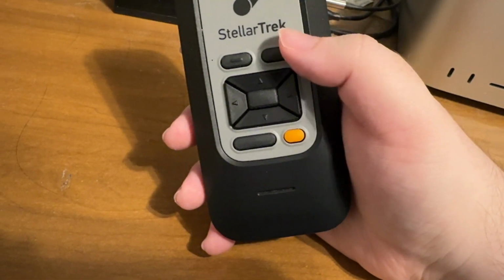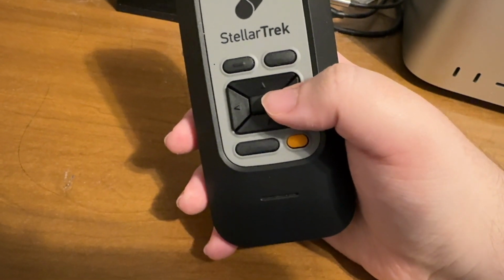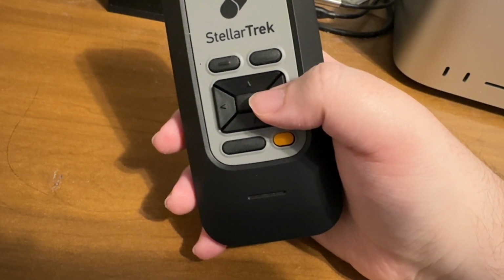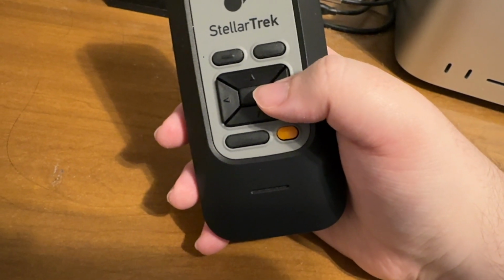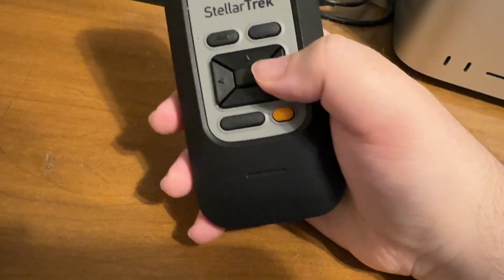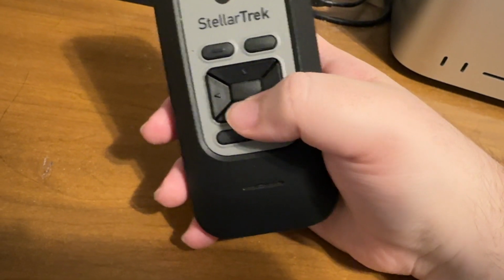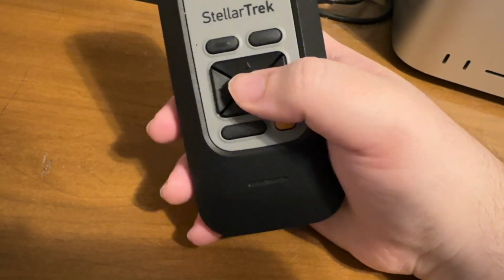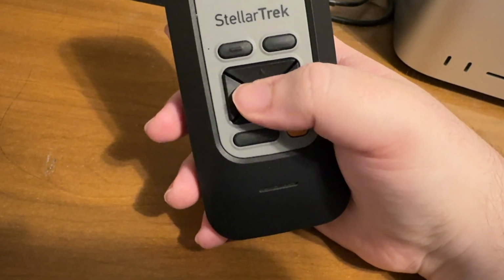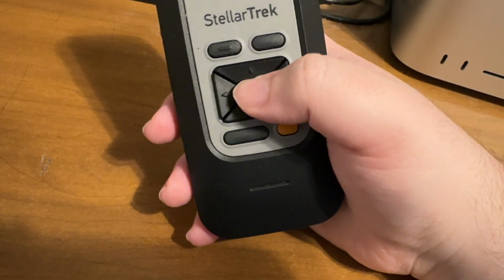Enter civic number. 1. And now we can enter in an address number. So in this case, we want 687. So let's find 6. 2, 3, underscore, done. Oops. Underscore, 3. So I'll down arrow. 6. And there's 6. Down arrow again. 9. And left arrow to 8. 8. And left arrow one more time to 7, and press confirm.